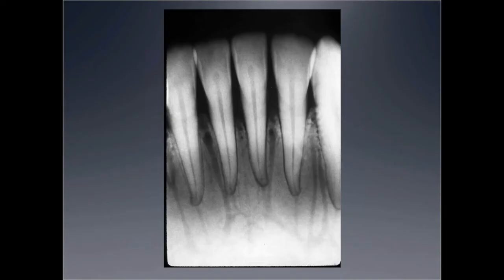So yeah, we see this quite a bit. It's the nutrient canals, which basically appear radiolucent radiographically in some people in the anterior area. I have to tell you that I used that radiograph to test residents, and the poor people, having been tortured with weird stuff, only 1 out of 10 recognized it. They knew what it was, but if you show people a lot of strange things, then we have to remember to keep our cool and be able to recognize the garden variety. So that's a good teaching tool.